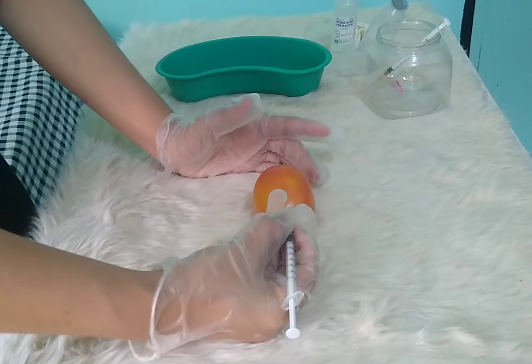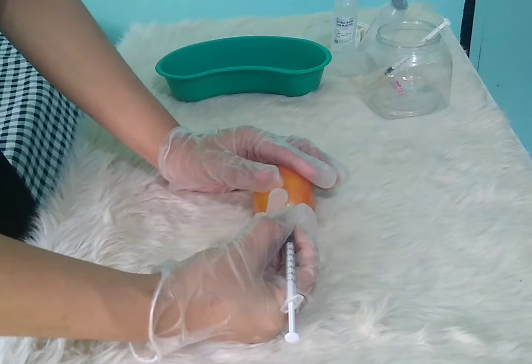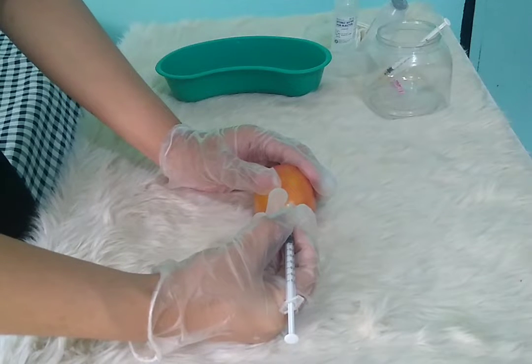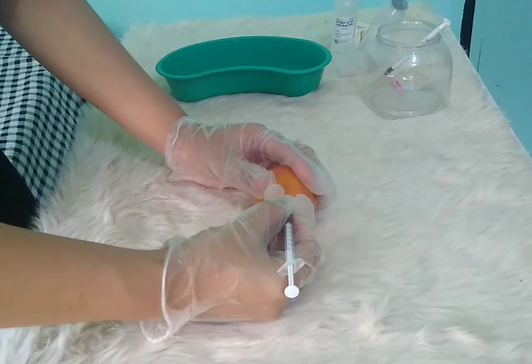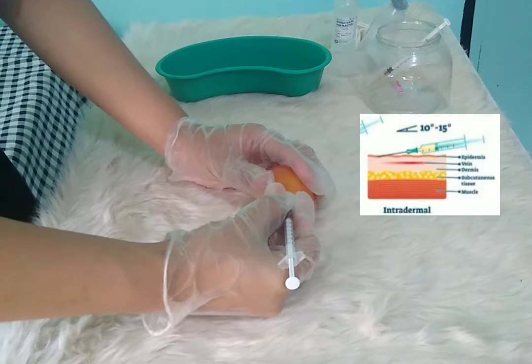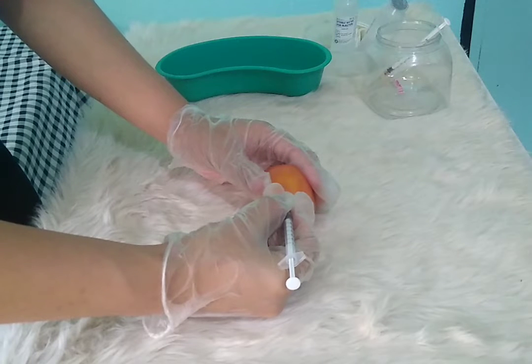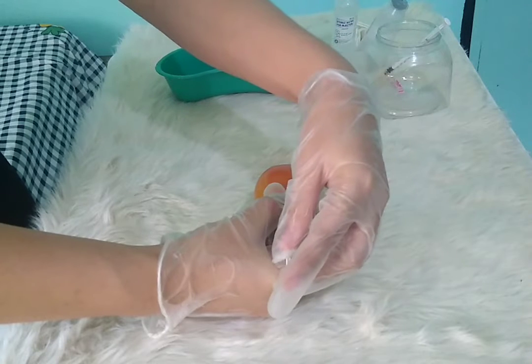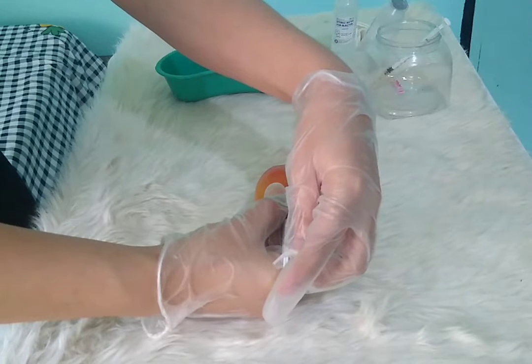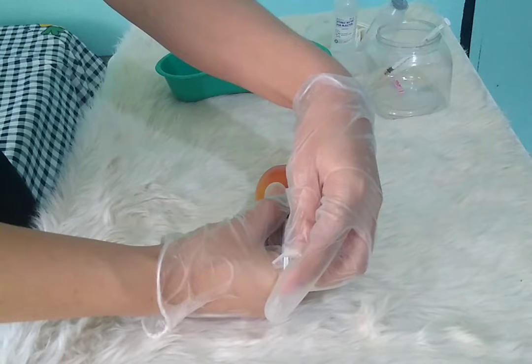And now we can inject the fluid. With the non-dominant hand, pull the skin at the site until it is taut. And then insert the tip, far enough to place the bevel through the epidermis into the dermis. Stabilize the syringe and needle and inject the medication carefully and slowly so it produces a small wheal on the skin.